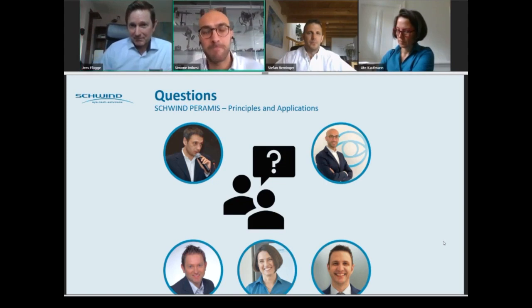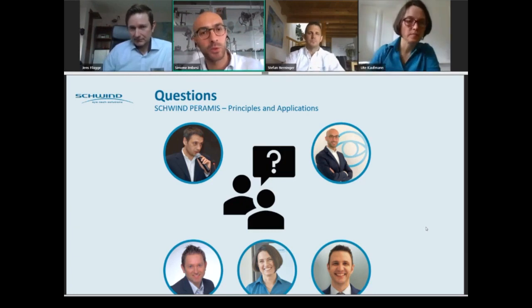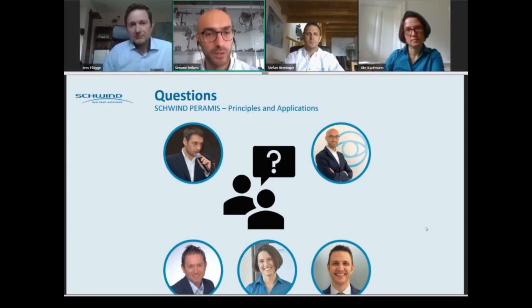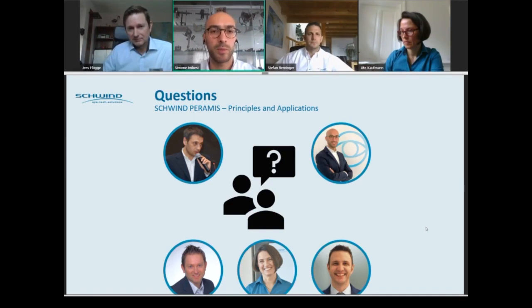It is a good question. Maybe the most accurate way is not using the refractive power map if you want to analyze the morphology. Okay, so if you need to analyze the morphology, I suggest to use a tangential map, if you want to analyze the diameter of the treated zone. If you want to analyze the refractive outcomes, you better use the refractive power map.